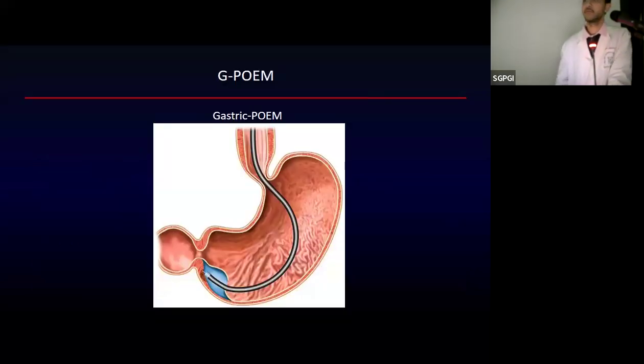Now, from POEM to its modification, which is G-POEM or gastric POEM, which is done in patients with gastroparesis.